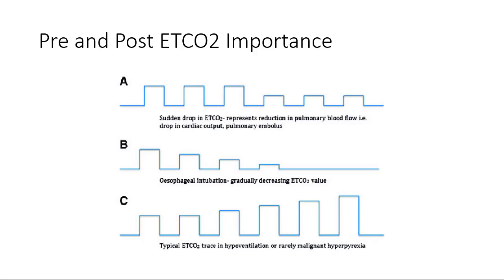Now, here's something else I want you to keep in mind: if possible, if you can get end-tidal CO2 before you intubate, do so. Thinking why?